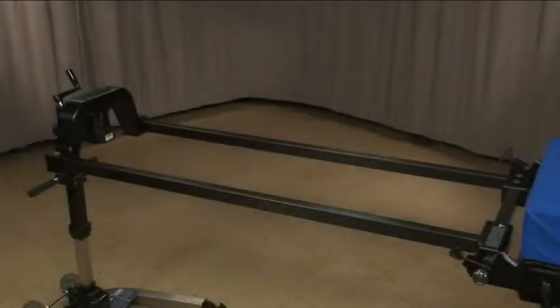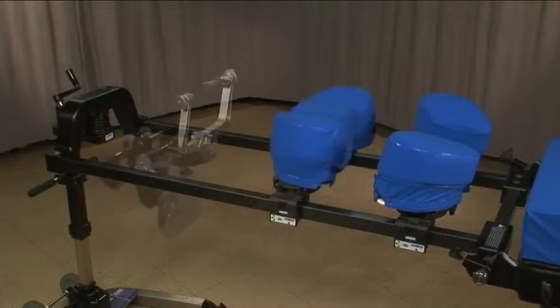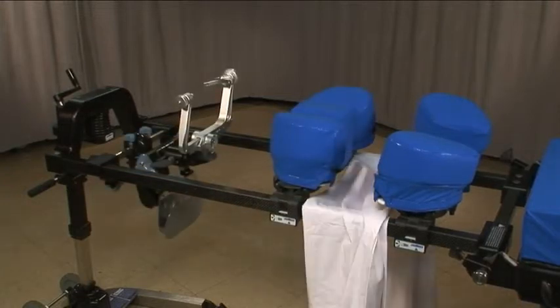The recommended products for posterior cervical procedures include the wing set system, the C-Flex, and a sheet for wrapping the patient's arms.